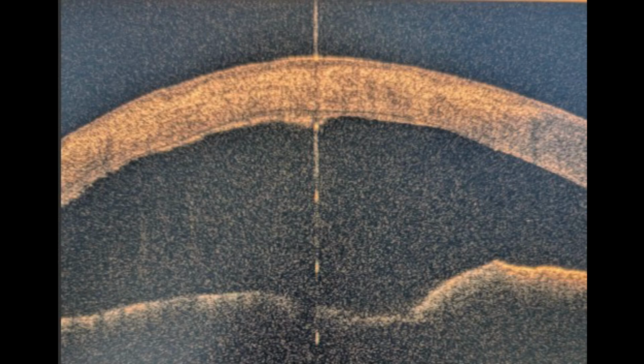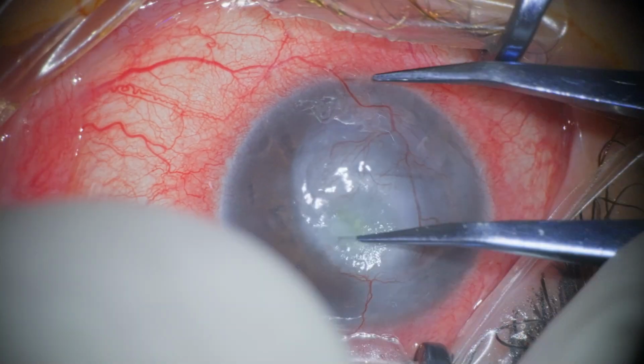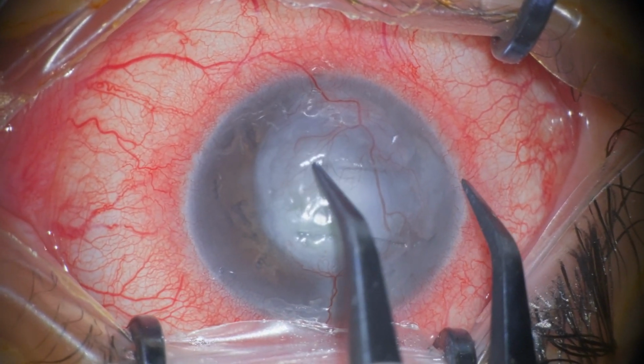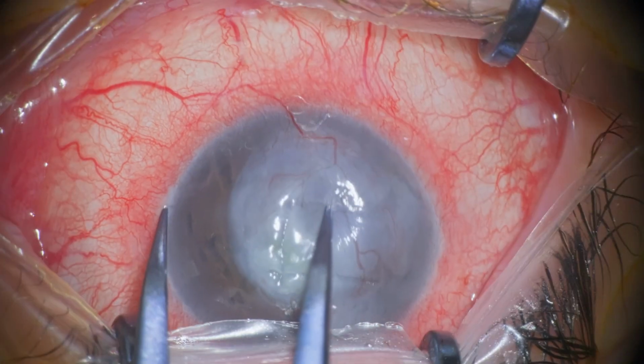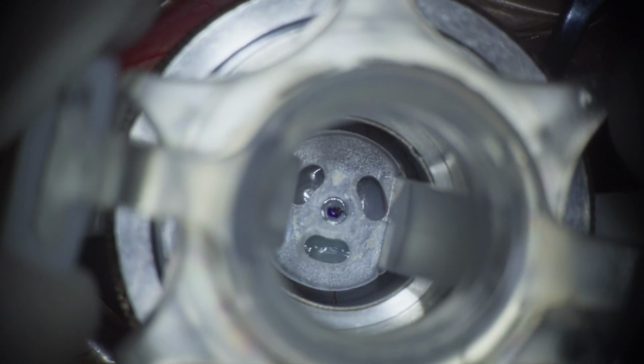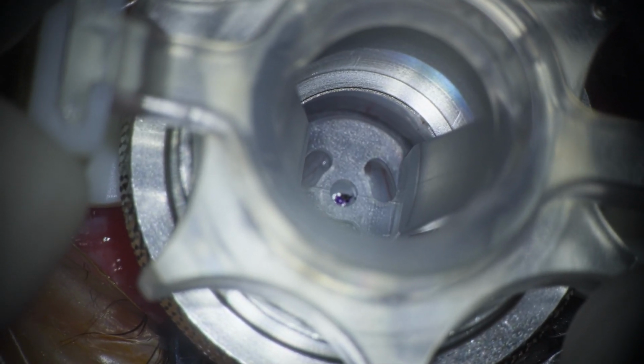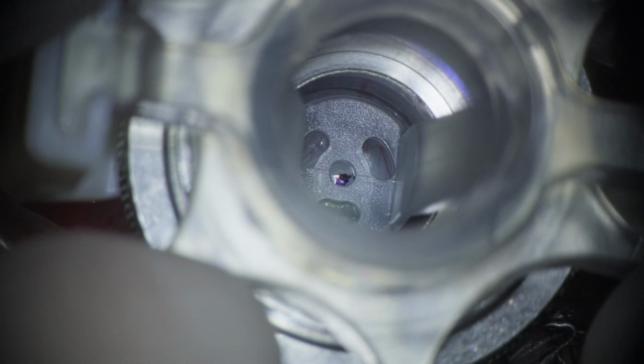If during surgery we could find some telltale sign that the endothelium is fine, then we could decide intraoperatively whether to preserve it or continue to do a PK.